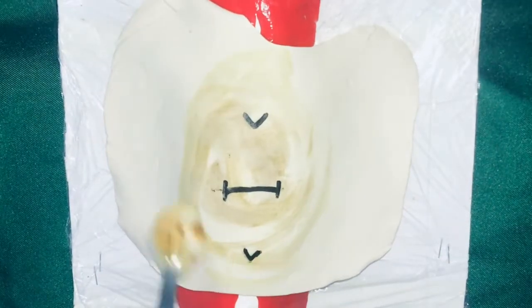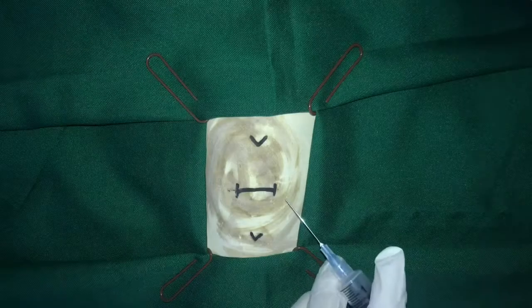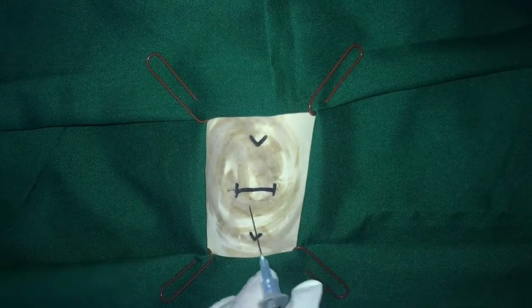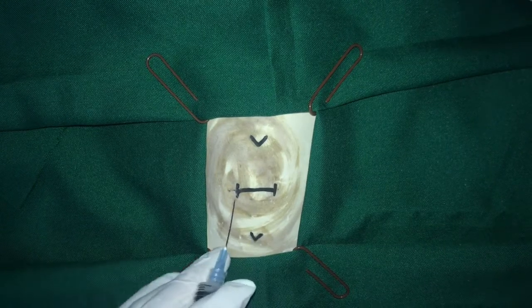Sterilize the skin of the anterior neck and chest and drape the neck accordingly. Unless the patient can be safely intubated or can be ventilated with a mask, a tracheostomy should be done under local anesthesia.